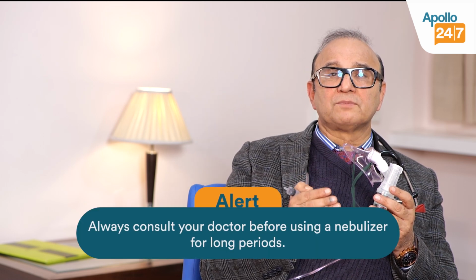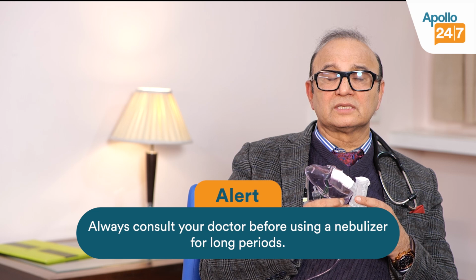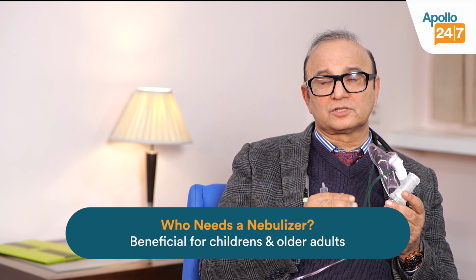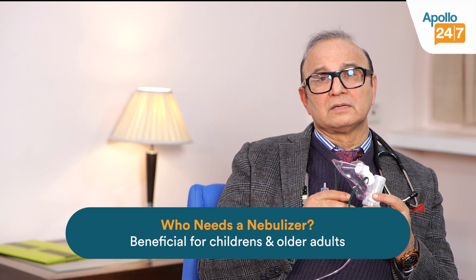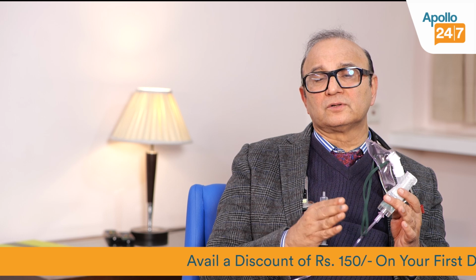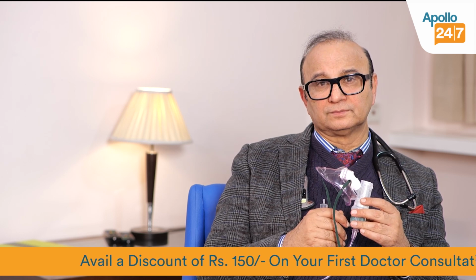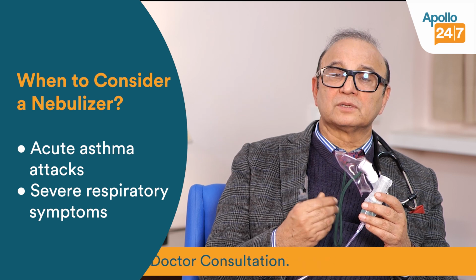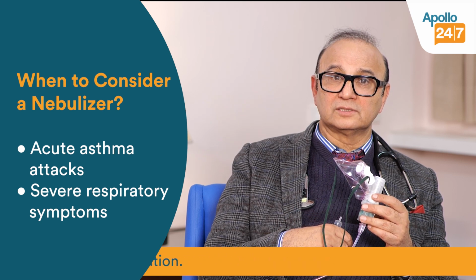It is not that if you are getting benefit with the nebulizer, you keep on using this. You must consult your doctor. These are very useful for small children and old people, but an adult can easily take inhalers if he is not very sick. But there is no harm in taking otherwise, but usually they are mainly meant for the children and the elderly people, or a person who has an acute attack or has a severe symptom, then also he can take nebulizers.